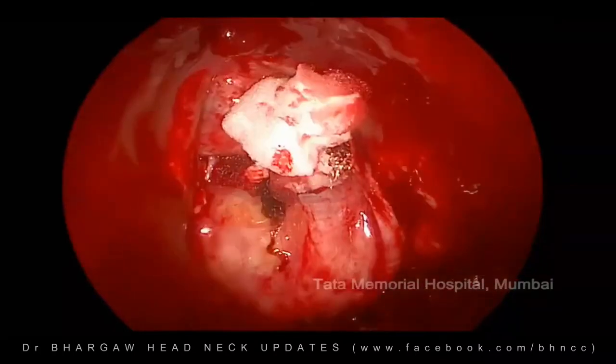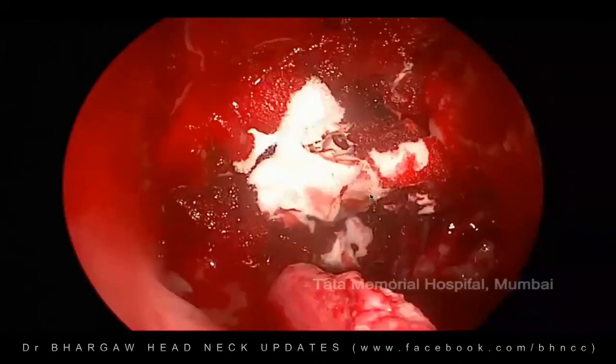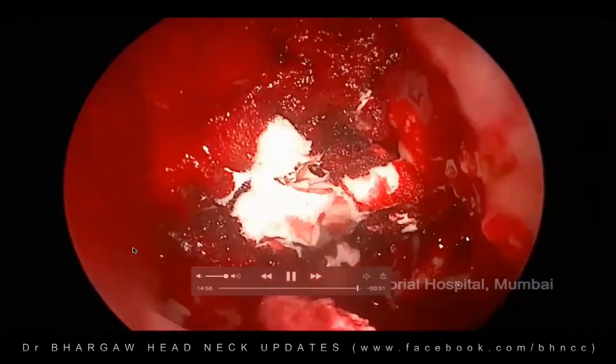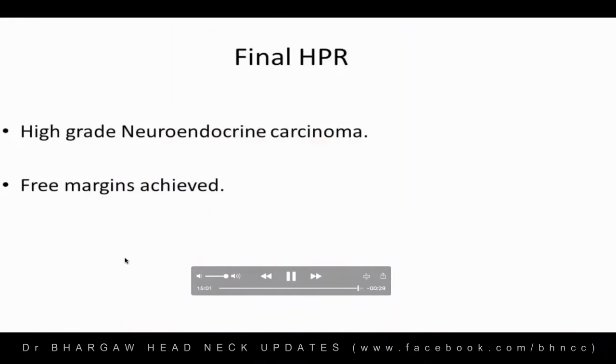So no nasoseptal flap, nothing is possible. You see the pulsation there. It's a good seal that has been achieved. And this patient went on to receive adjuvant radiotherapy, and all margins were free. So he's finished his treatment. He's on follow-up right now. And that's the end of this. We can take questions so far.